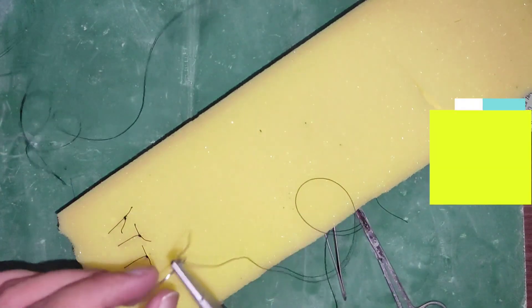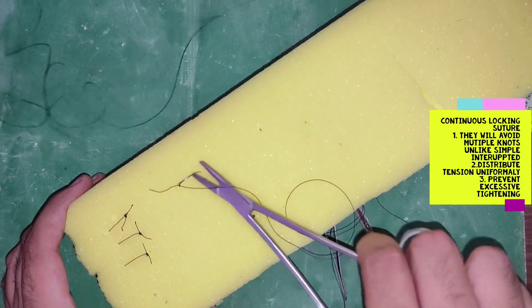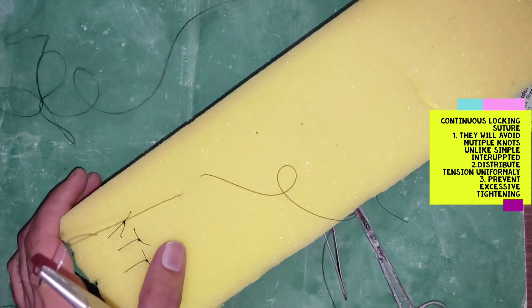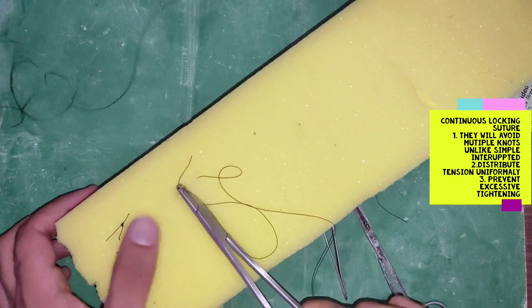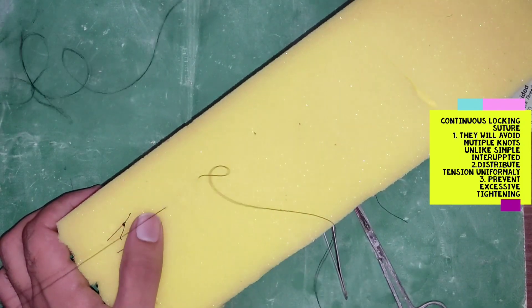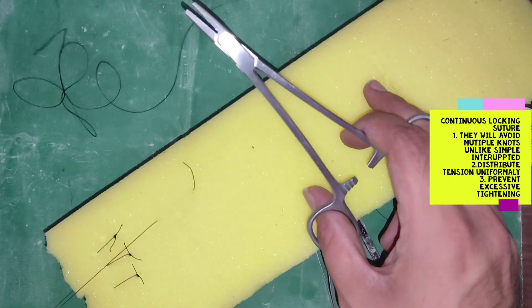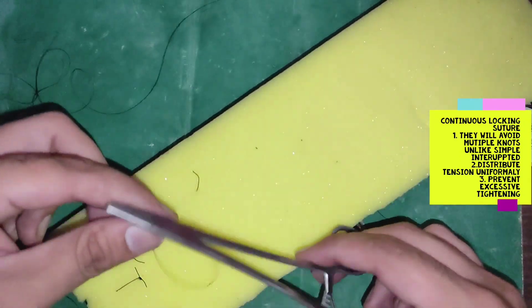The second suturing technique is continuous locking suture. In this technique, you avoid multiple knots, unlike the simple interrupted suture.